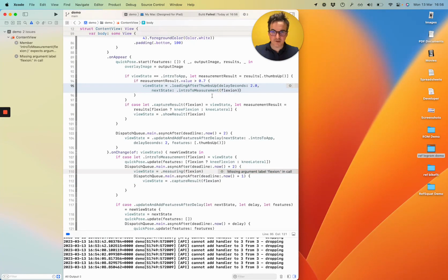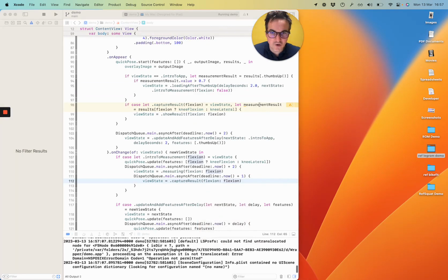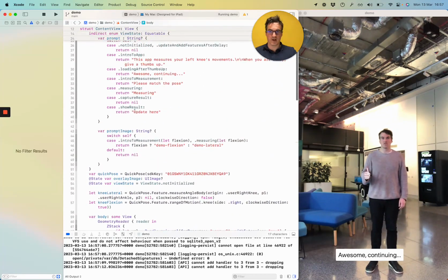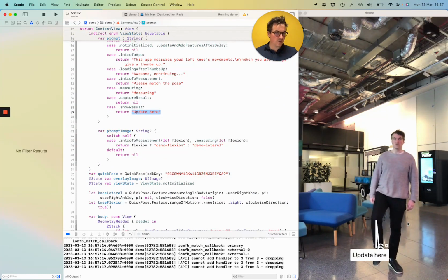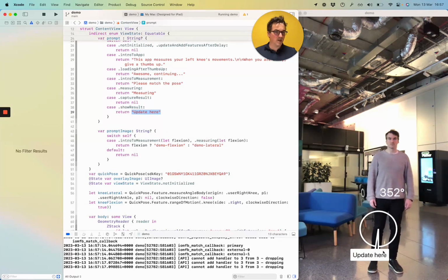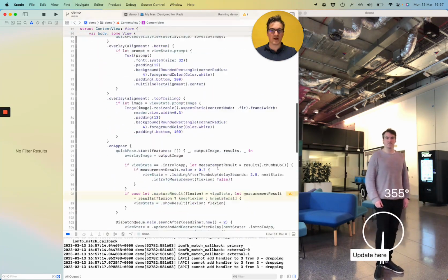Intro to measurement, flexion. Well, when it's the intro to the app, we need to choose a flexion or a lateral measurement to start with. So I'm going to start with my lateral measurement because that's what I've recorded in my video. Okay, so we're getting a warning here, which means we're not actually using the measurement result. That would make sense because we're going to have a bit of an error here when it says update here. But what we're after is keeping the measurements in line. So when it gets to update here, I give a thumbs up in the video, so I'm expecting to validate that result.